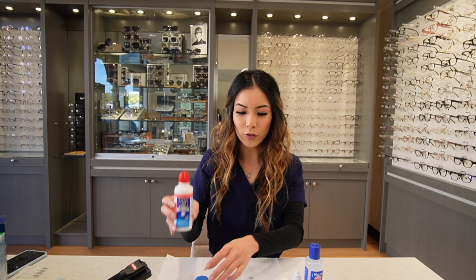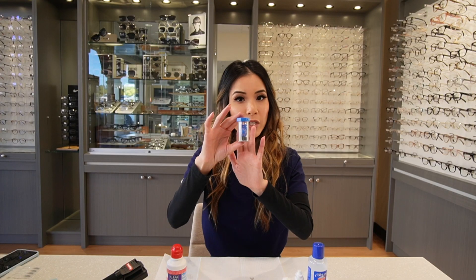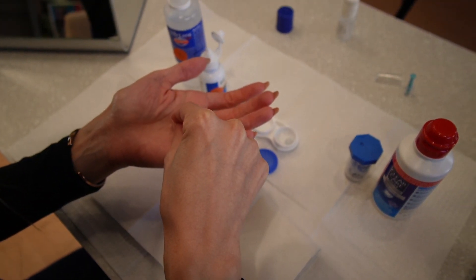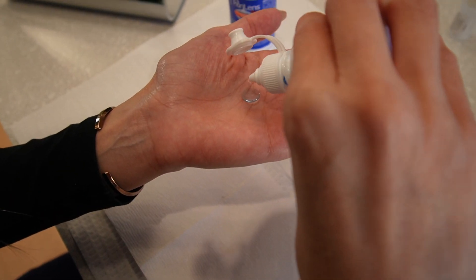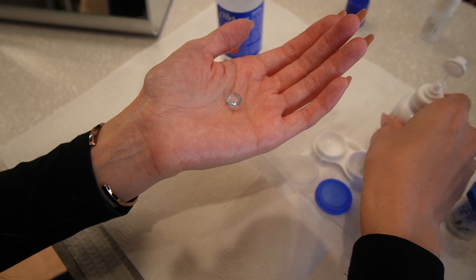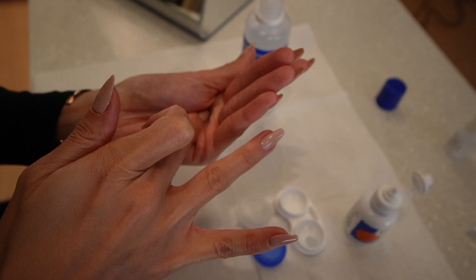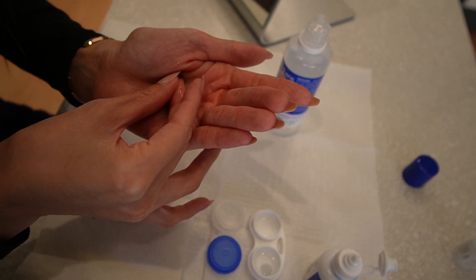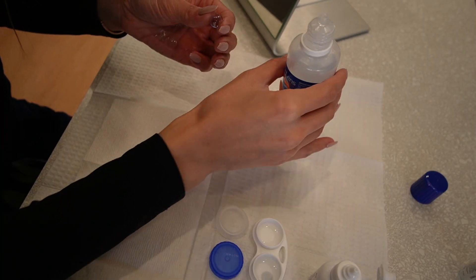In the Clear Care box, you'll notice that it comes with a small container like this. Before we do anything with the container, let's rinse out our lenses. Place the lens into the palm of your hand, take the Boston solution, put one drop, and rub the lenses. After that's done, open the Pure Lens bottle and rinse your lenses.